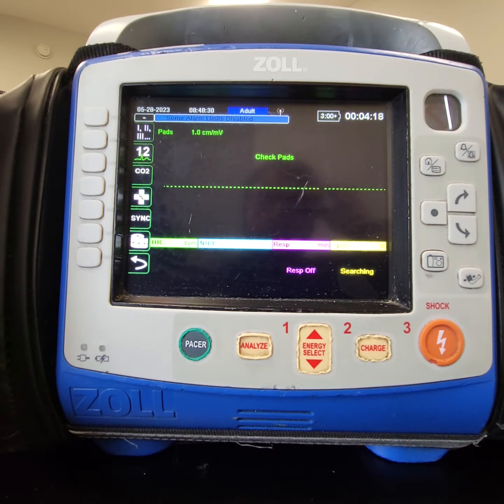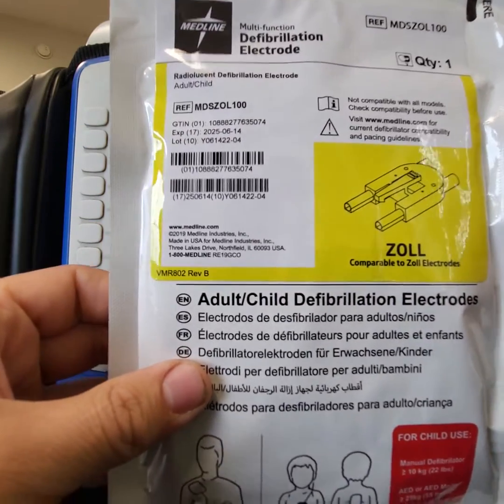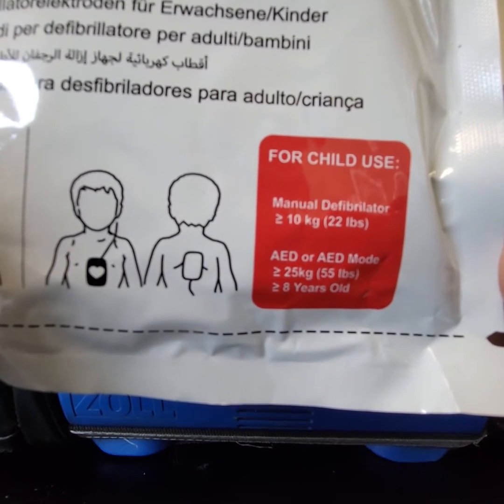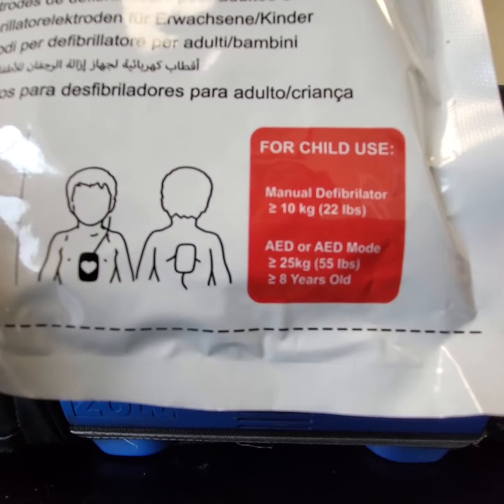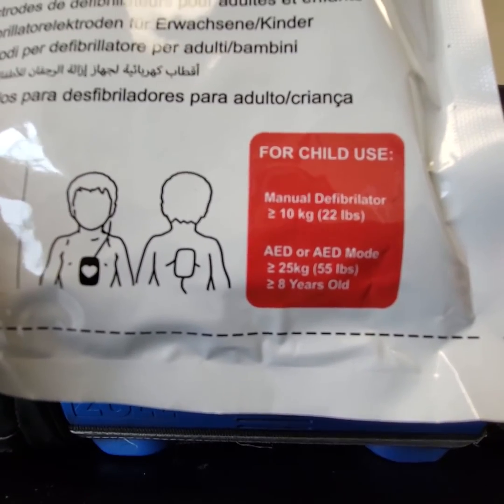I just wanted to bring everyone up to speed on how these pads are used in contrast to our adult and pediatric pads that were separate. If you haven't seen these pads yet, this is the packaging they come in and you can see the dosing guidelines on here for child use: AED mode for patients less than or equal to 55 pounds or less than or equal to eight years old.